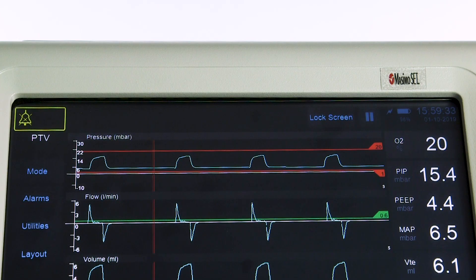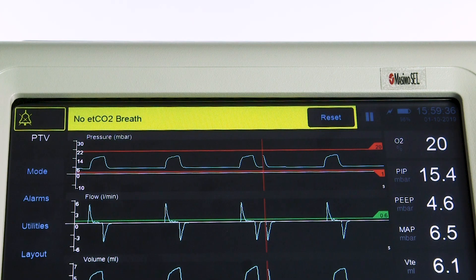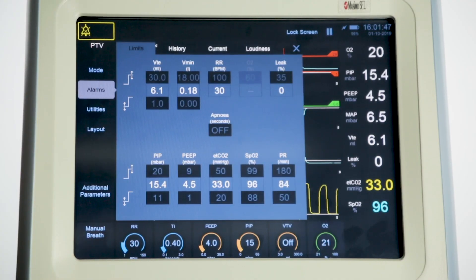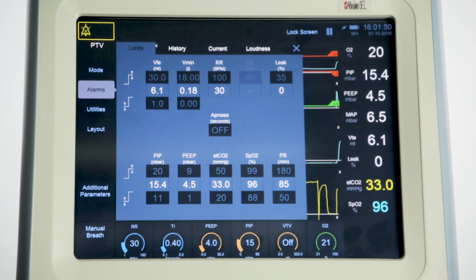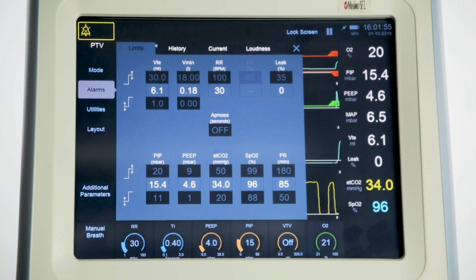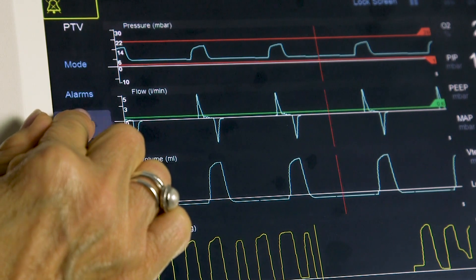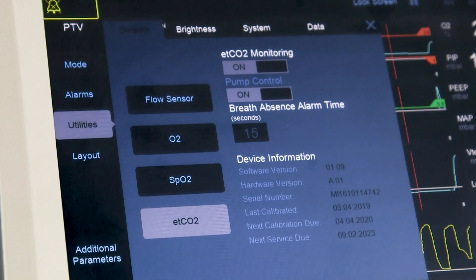The SLE6000 also provides alarms for the CO2 measurements, which can be viewed and changed by accessing the alarm tab. The user can set high and low CO2 alarm limits. As previously mentioned, the breath not detected alarm is set in the utilities menu.